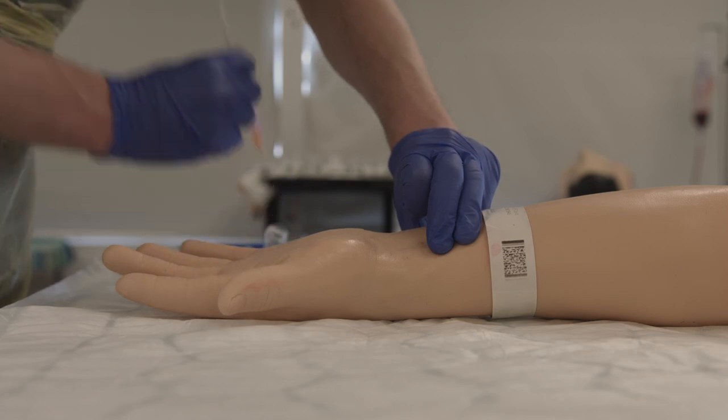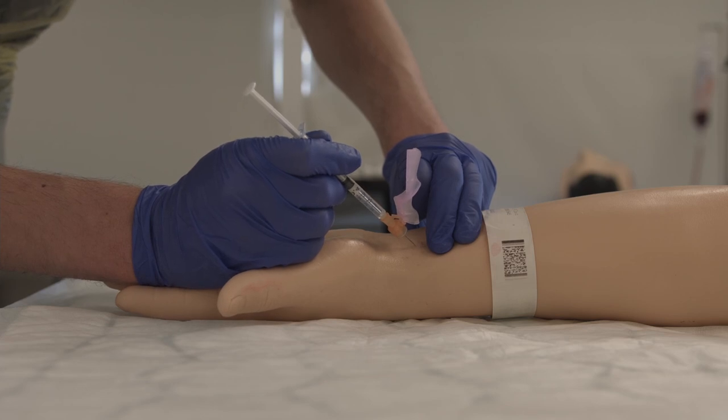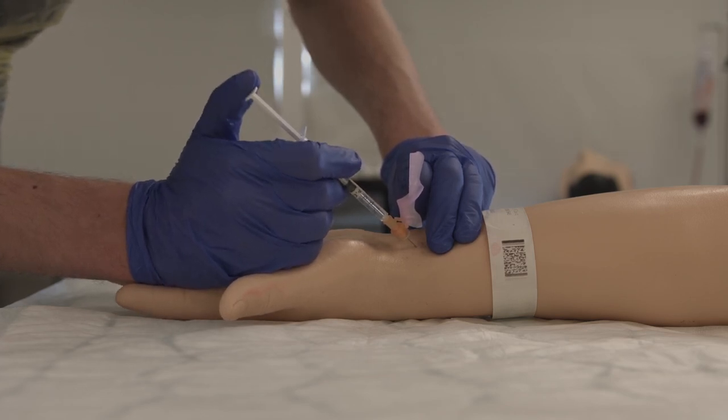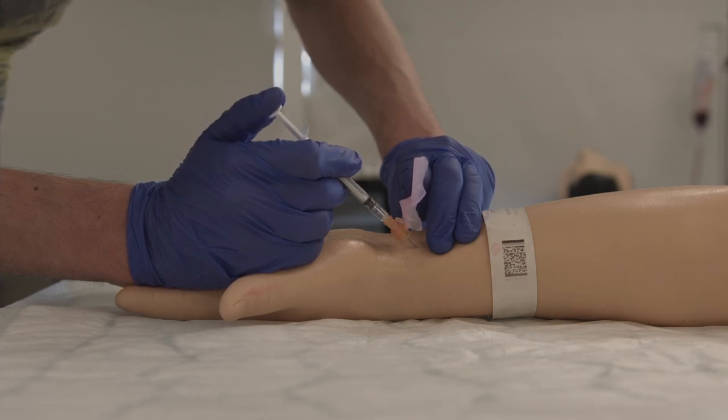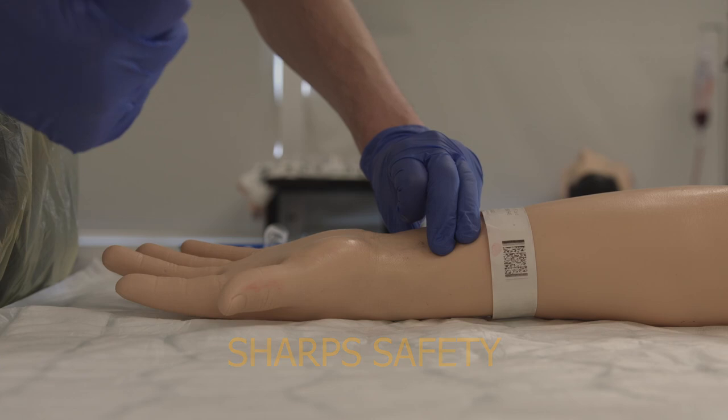Take your lidocaine syringe and insert it where you felt the pulse, with the needle tip just under the skin. Then administer the lidocaine. Cap your needle and put it in the sharps bin immediately.